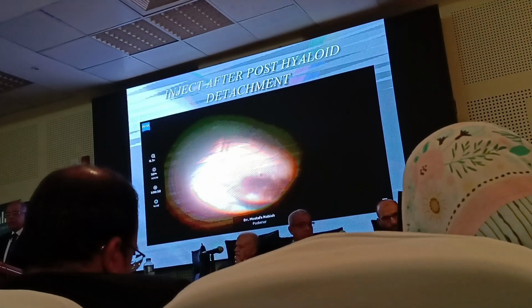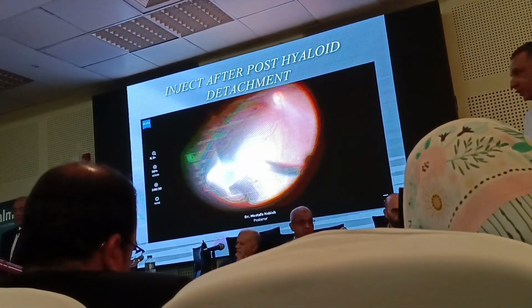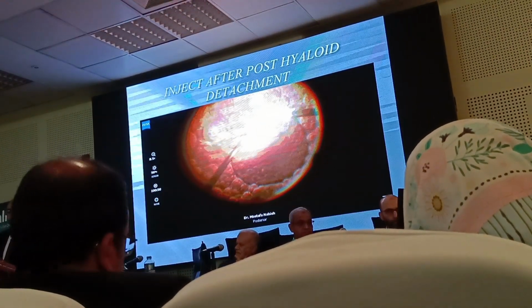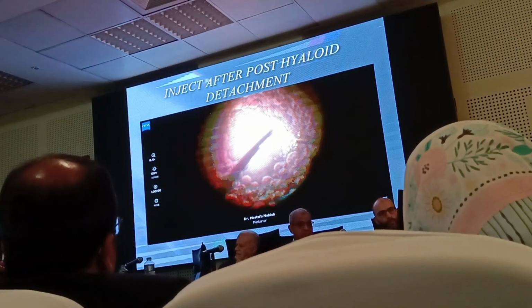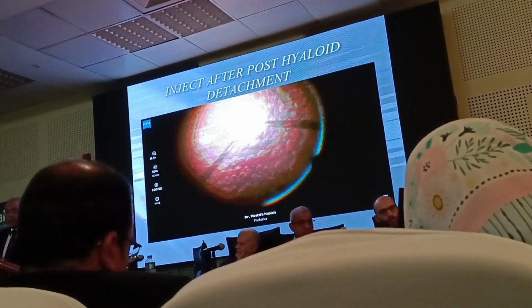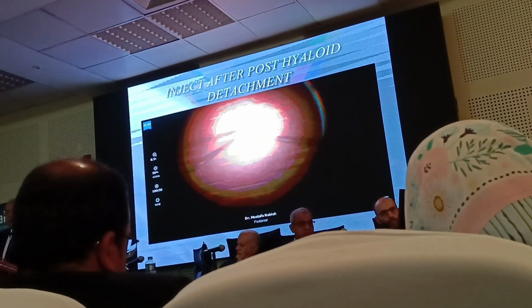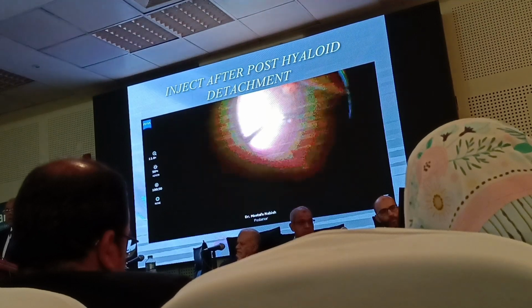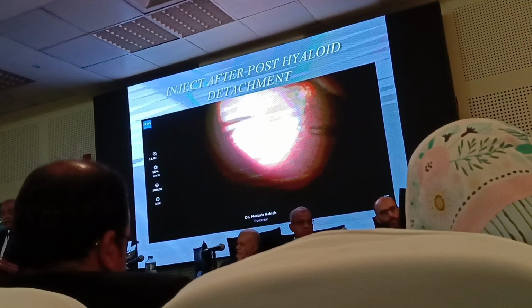When to inject, you should not inject perfluorocarbon on the retinal surface except after removing the posterior hyaloid. Here, I thought I removed the posterior hyaloid. I started injecting perfluorocarbon. I did the same maneuver I'm using always, but you see that it was divided into frog egg-like bubbles. So I spent a long time removing these bubbles and restained.